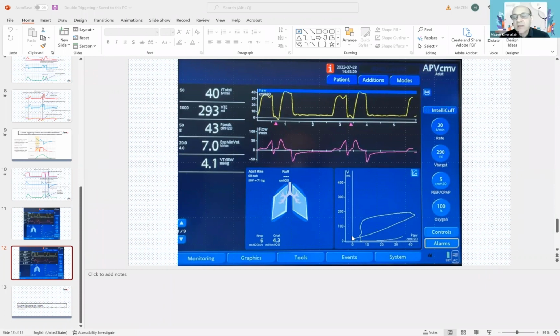Excellent. So at least it's going to be a larger tidal volume than the initial one, but it would not be double the target tidal volume. You're right. The pressure is going to be the same, so you're not actually breaching the pressure limit in protective lung strategy. The volume will be added, more volume will be added, so you may actually breach the limit for the tidal volume. But compared to volume control, where the pressure is doubled and the volume is doubled.